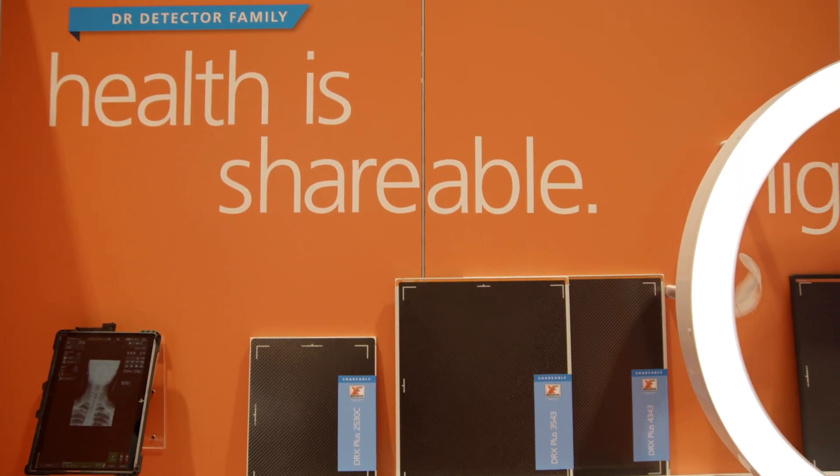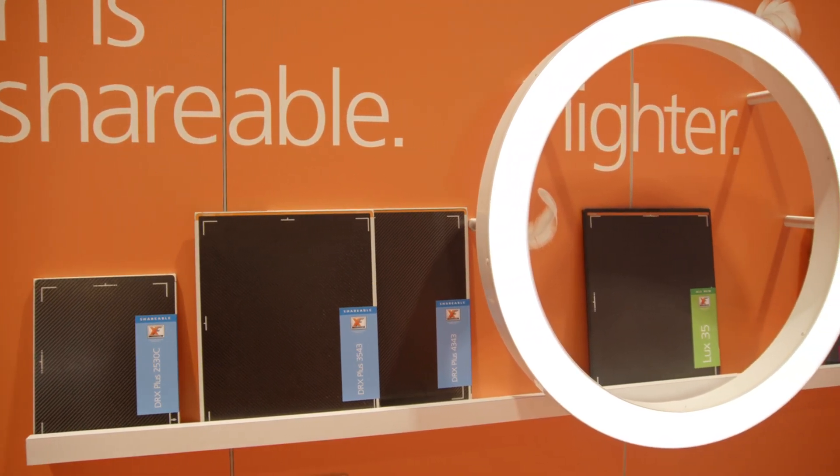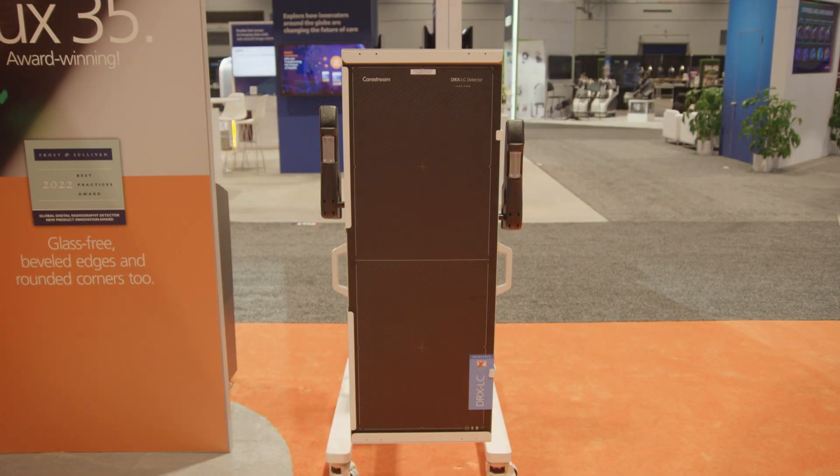Let's take a closer look, starting with our premium detectors: the DRX Plus, the glass-free Lux 35 detector, and the brand new DRX LC detector.